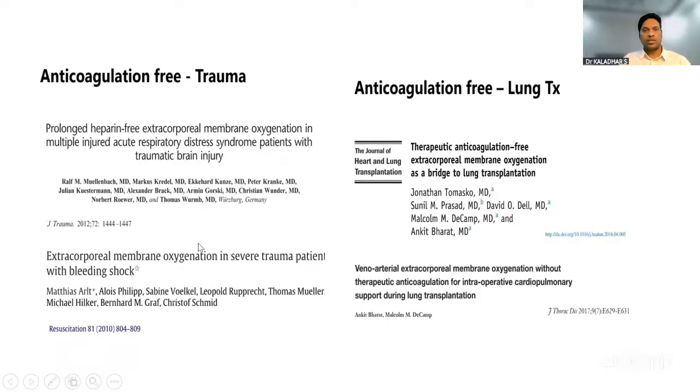These are the instances where I could come across different case reports where they tried without any anticoagulation. They mostly used heparin coated circuits in these situations, and even anticoagulation-free lung transplantation has been tried intraoperatively. Most of the time, these were short run ECMOs, probably a few hours to maybe a few days, but longer run ECMOs probably still need anticoagulation.